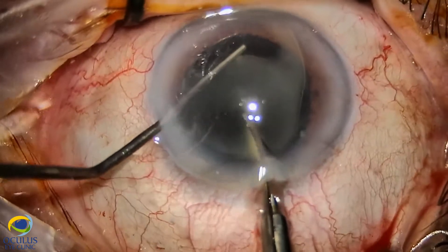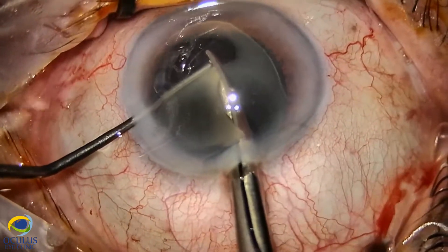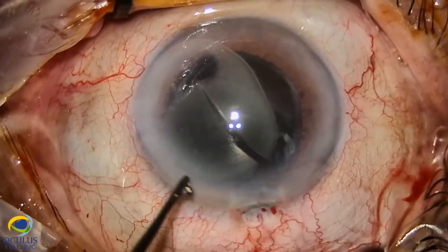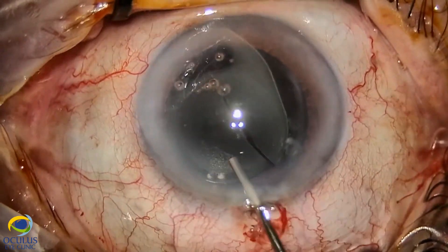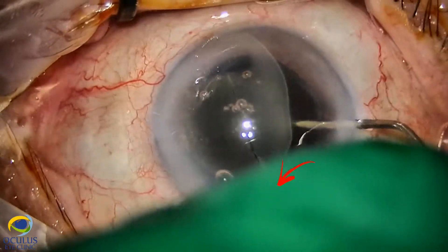So we needed to perform more gentle maneuvers under OVD, behind the IOL and on top of it. We gently cut the lens in three pieces.